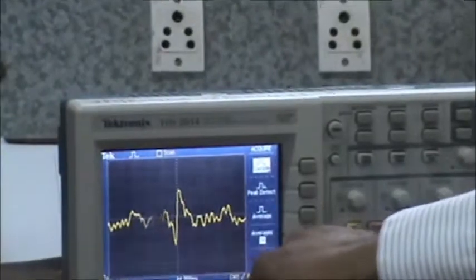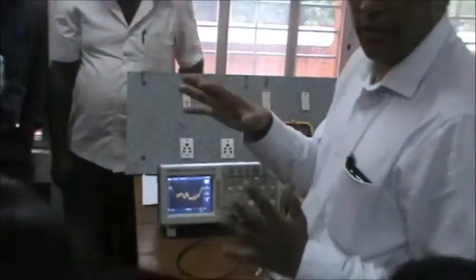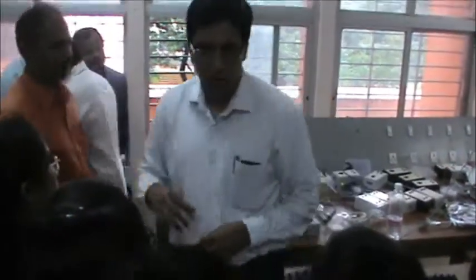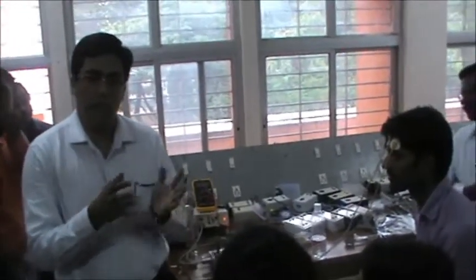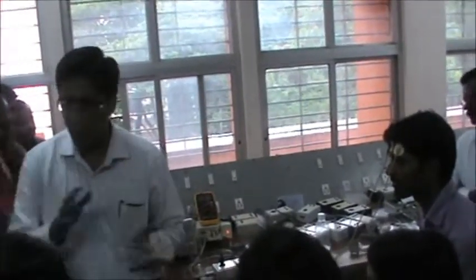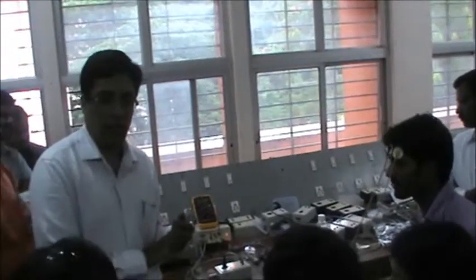So already you are getting the EEG. Less than 10 hertz basically. Whatever frequency you are getting is less than 10 hertz. So once again this has to be filtered. So between 0 to 3, 3 to 7 or 8, 8 to 12, and 13 and above. We categorize them into different sets of frequencies: delta, theta, alpha, beta.